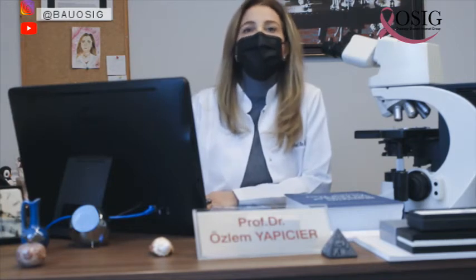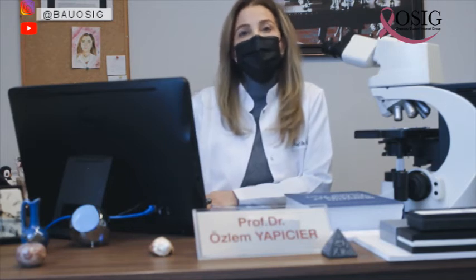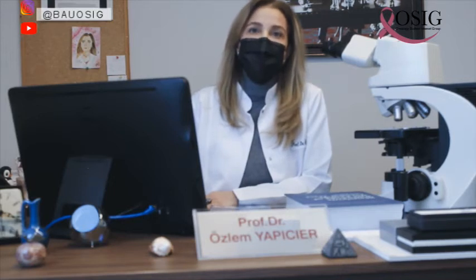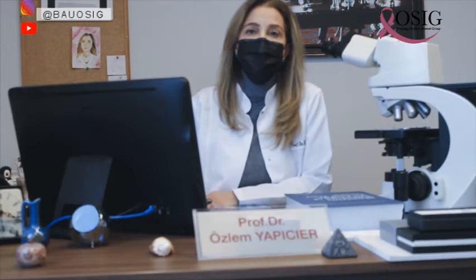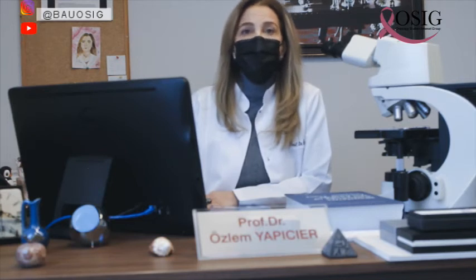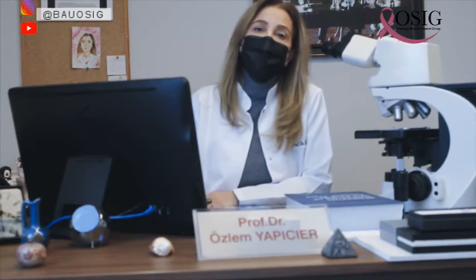This technique improves the specimen adequacy and also the detection of precancerous lesions. And as you know, the primary cause of cervical cancer is human papillomavirus. This latter technique also has the advantage of showing low risk and high risk HPV by looking at HPV's DNA.